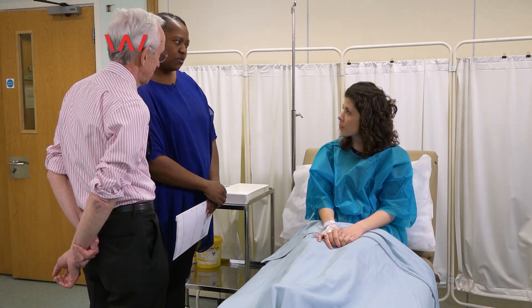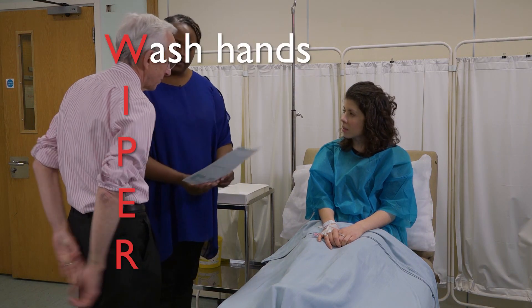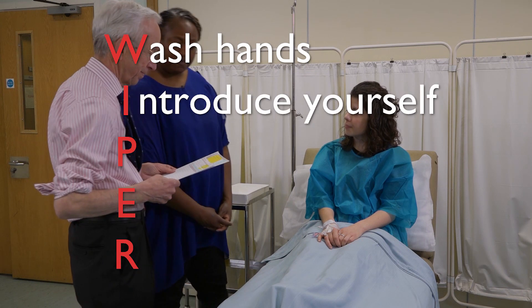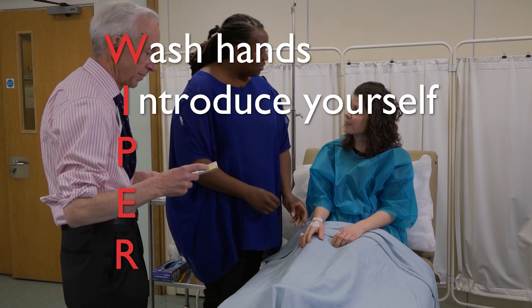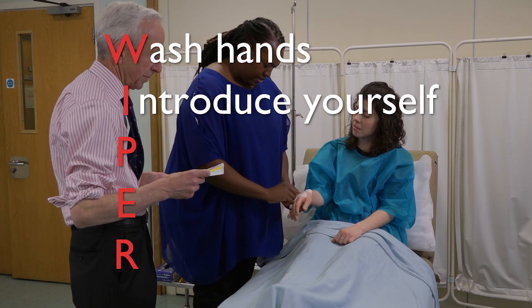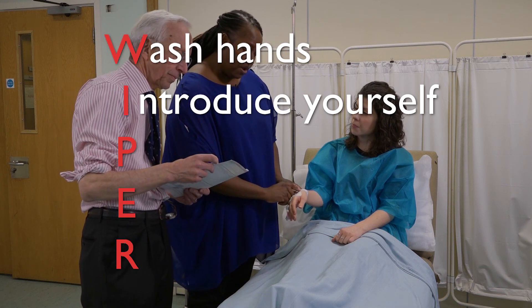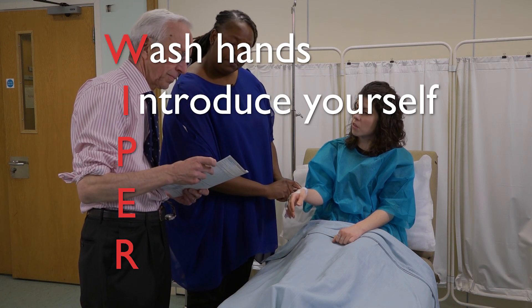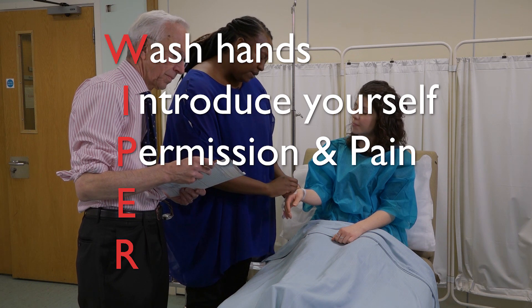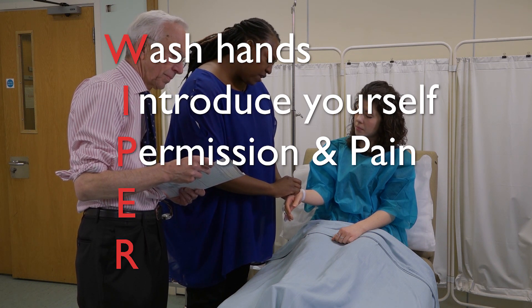Begin by performing WIPER. Wash your hands, introduce yourself to the patient and confirm their name, date of birth and if they have any allergies. Explain the procedure and seek permission to perform the procedure.